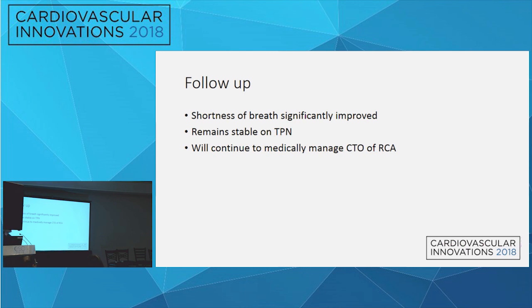Similar thing, I mean, if you have a low EF patient with multivessel disease, you want a rota, you want an atherectomy, you always should think of no reflow and having support, as difficult as it could be. I think that is the way to go. And you could get lucky one time or two times, but it's going to catch you.